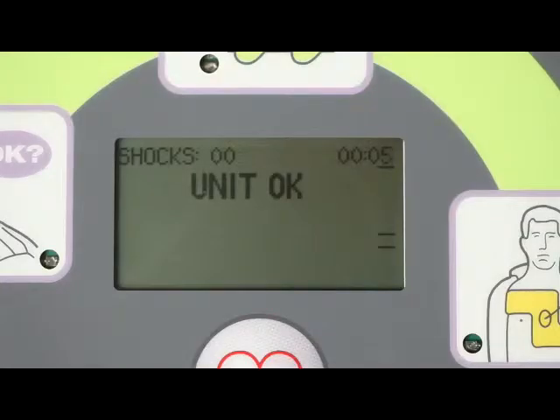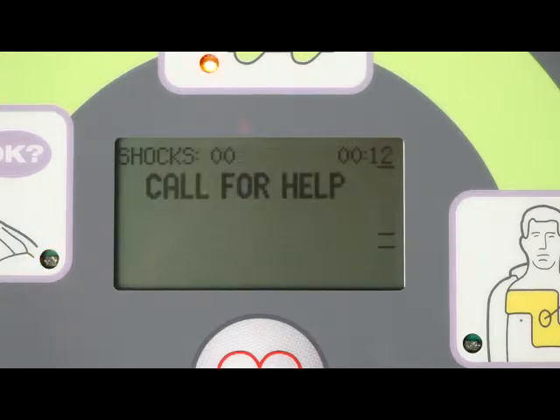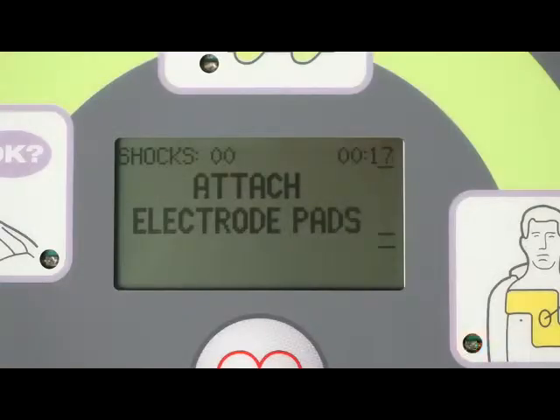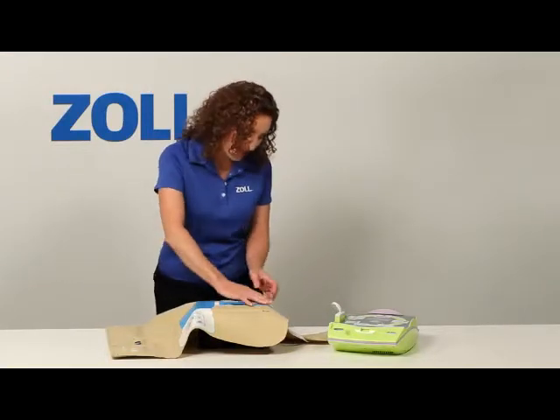Unit okay. Adult pads. Stay calm. Check responsiveness. Call for help. Are you okay? You! Call 9-1-1. Attach defib pads to patient's bare chest. Here, I would apply the pads.